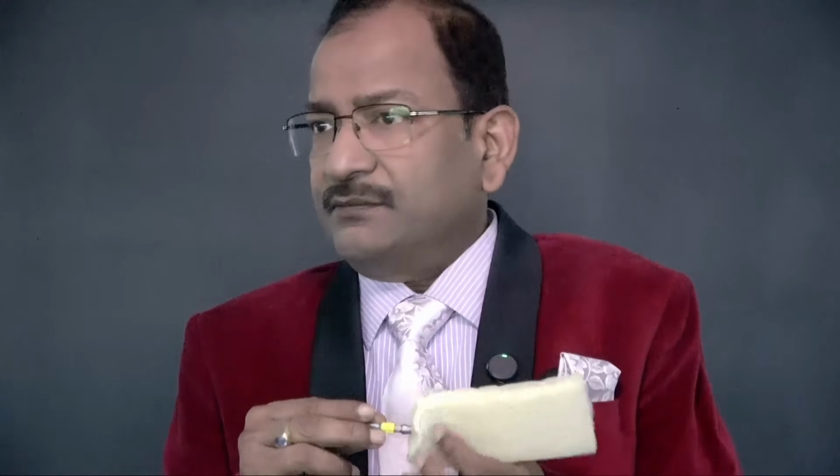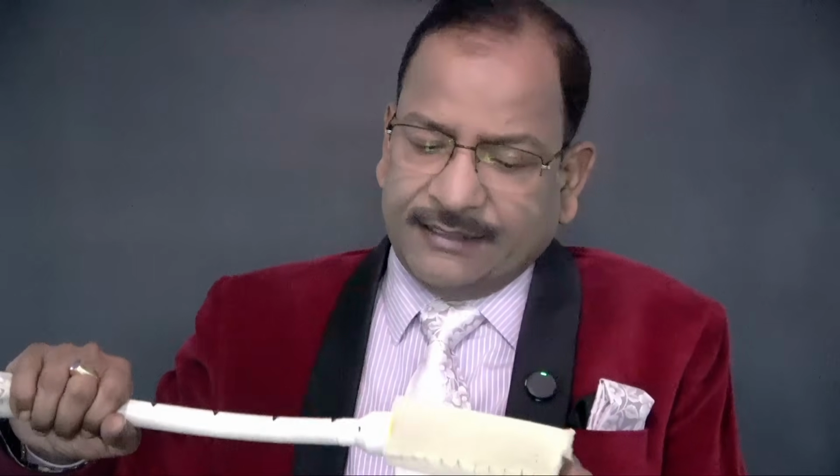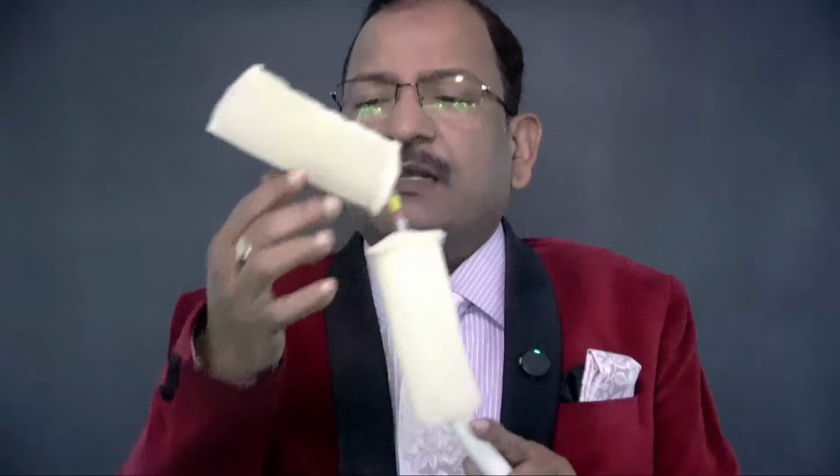And then you will use this anvil. It is called anvil because it is coming out from the anus. And in the RYGB, when we put the same from the mouth, we call it orvil. So this anvil is ready. After that, this is the gun. And the gun you will push through the anus. And then there is a perforator which will perforate. And after that, this anvil will be fixed with the gun.